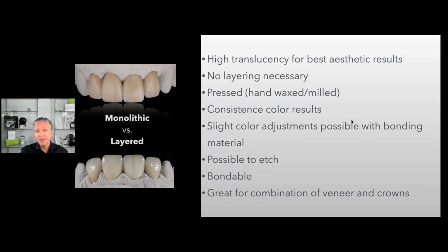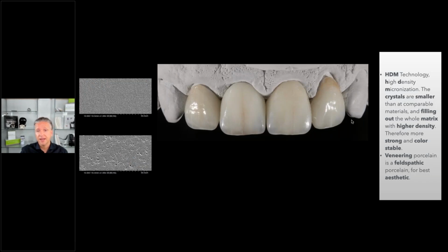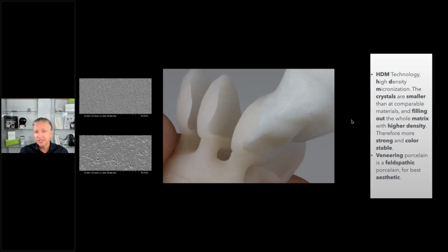Important to understand is that lithium disilicate is not lithium disilicate. There are differences. For example, generation 1 or 2 lithium disilicates are, in my experience, more on the rough side than GC LiSi, which has what we call the HDM technology, a denser, finer, and I would say cleaner material. What I realized is that when I press it and adjust margins very thin, I don't get any chipping, flaking, or porosities compared to other lithium disilicates. That's what I really enjoy about working with that material, because the end result is much quicker and more consistent to achieve. That's really what I like.